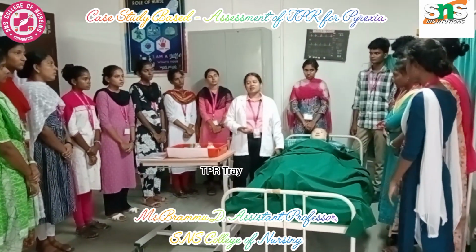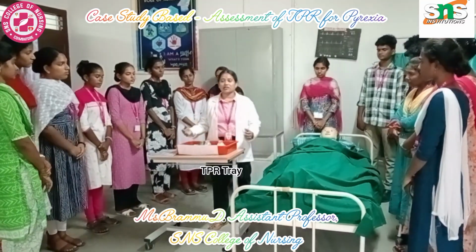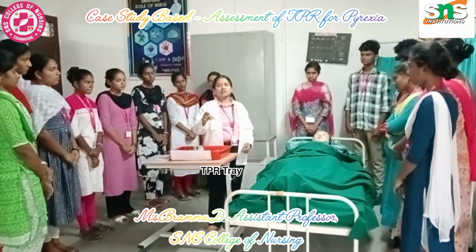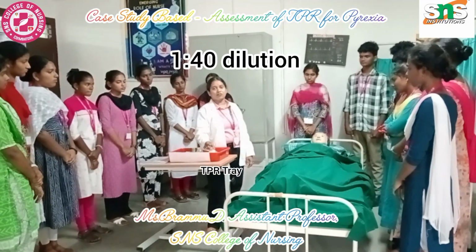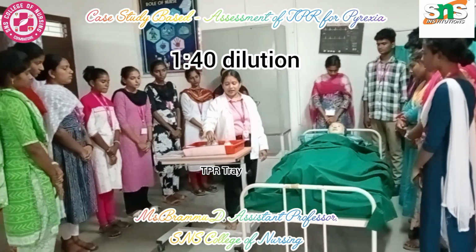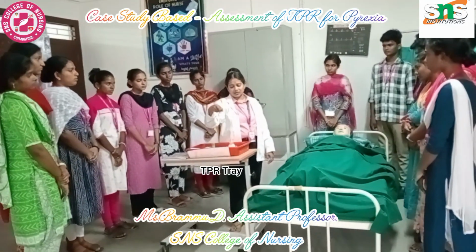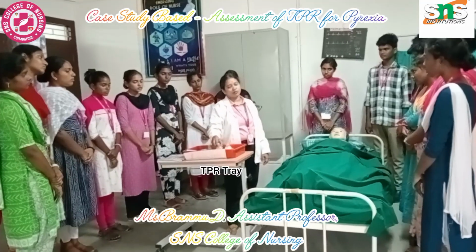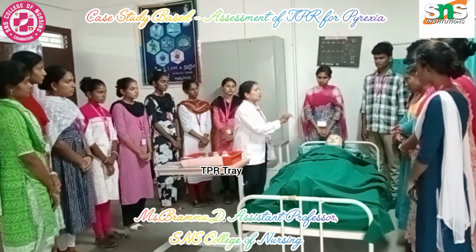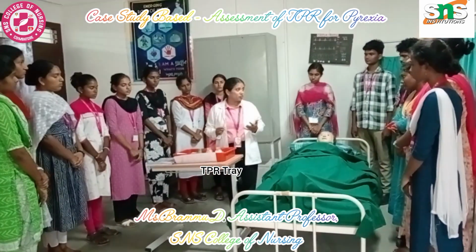During procedure, what are we going to do? Before you keep the articles by the side, as a nurse we have to prepare the lotion. If you are going to use Dettol, the dilution for disinfecting is 1:40. Then we have to have a separate bottle with cotton. This is for rinsing the thermometer, because if you directly place the thermometer into the patient's oral cavity, it will create an ill taste to the patient, which may induce vomiting.